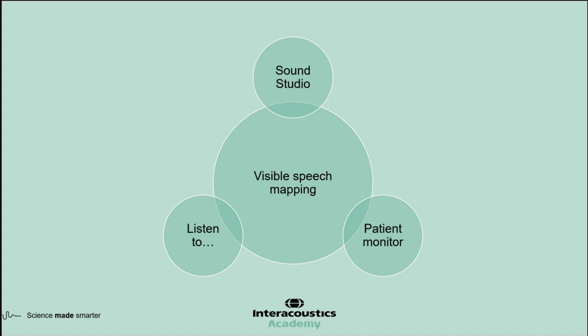The patient monitor screen allows you to demonstrate their audiogram in a really clean, clear way. The listen to feature, so this is the listen to probe mic or the listen to coupler feature. I think this is a fantastic tool. It allows you as the clinician to listen to what the hearing aid is doing.